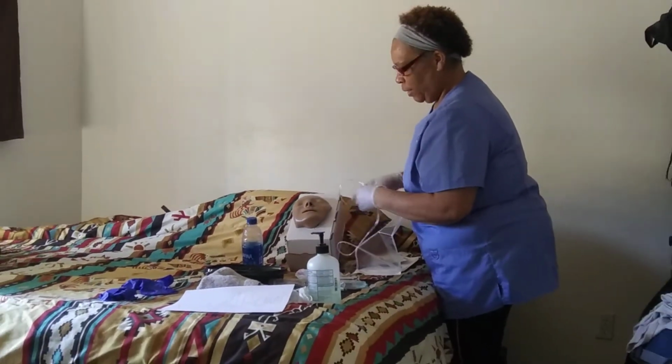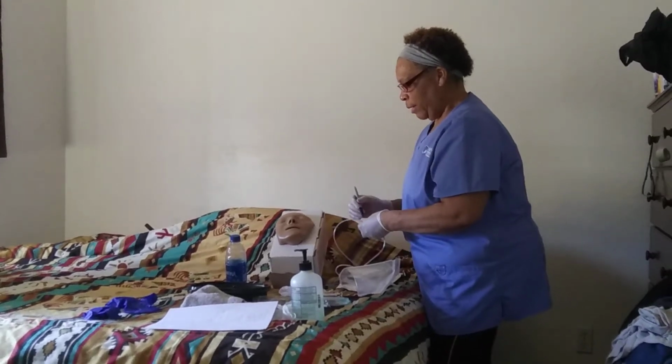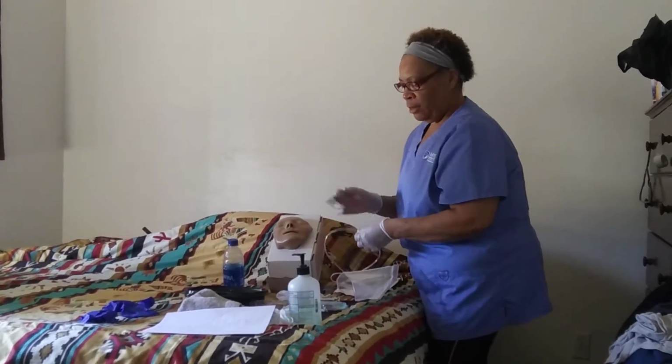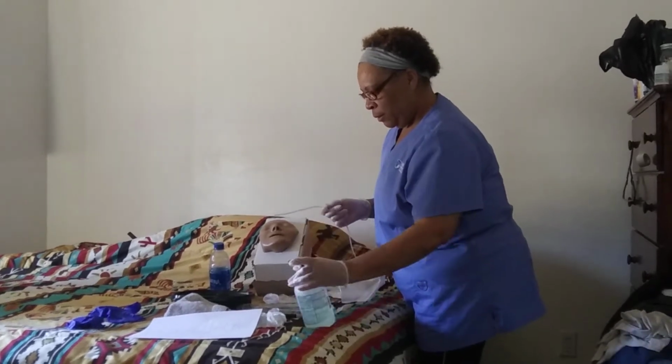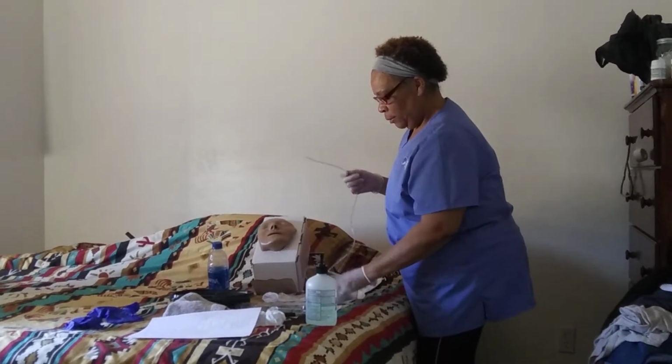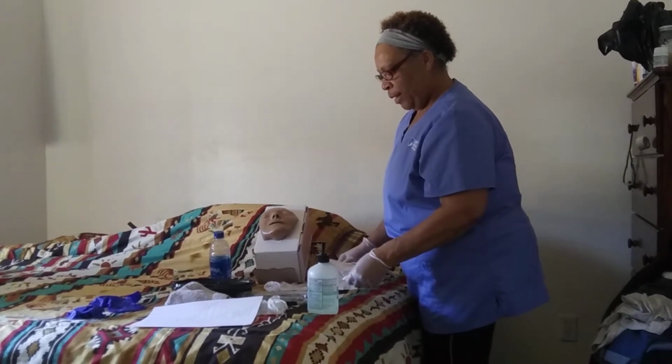Okay, once that's verified, I take my marker and make a little mark on there. This is to remind me how far I'm going down. I have my lube there.